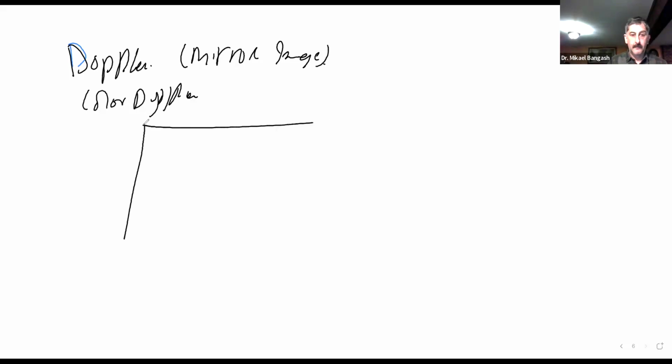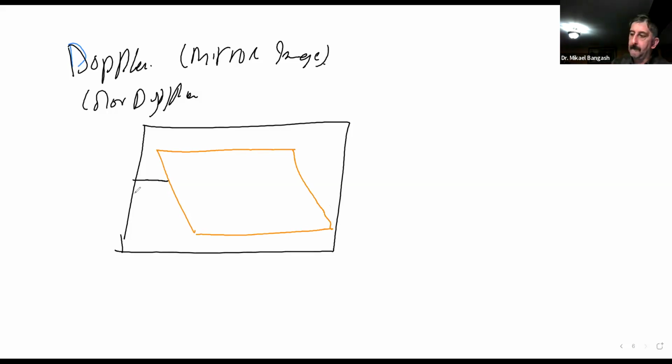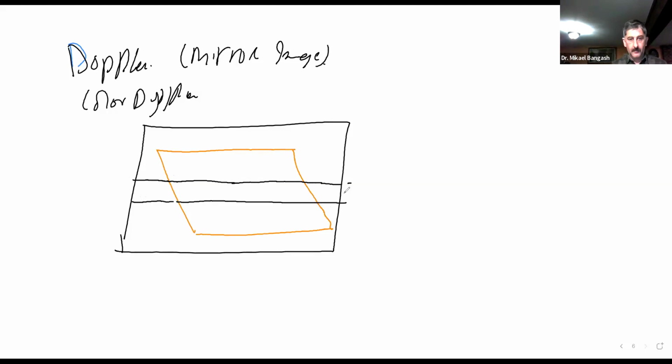Now we can say we have the image. Now, guys, this here is your blood vessel.